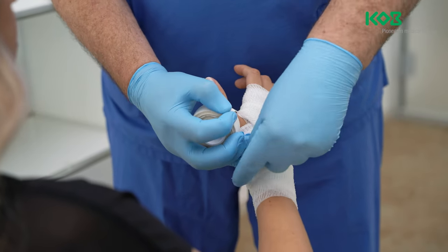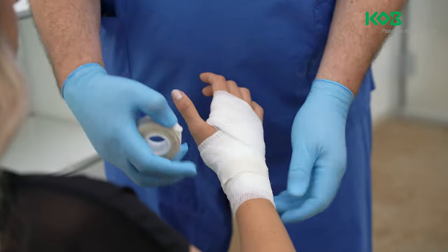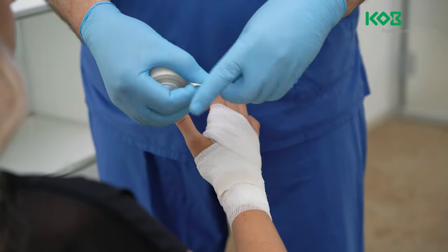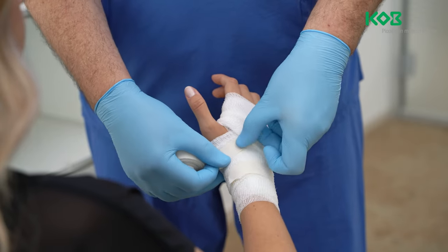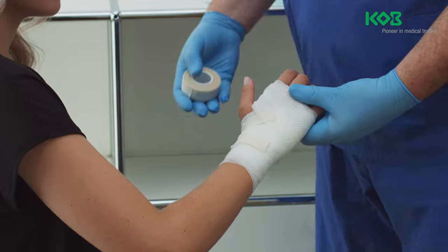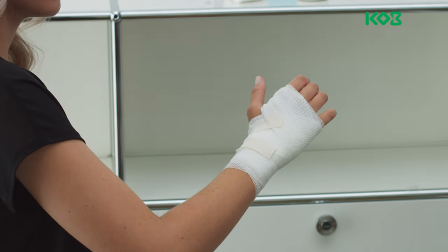Elastic, non-cohesive fixation bandages are particularly well suited to short-term applications requiring rapid action, because the beginning of the bandage is easy to find and the bandage is easy to unroll. Its open fabric structure also makes it skin friendly.